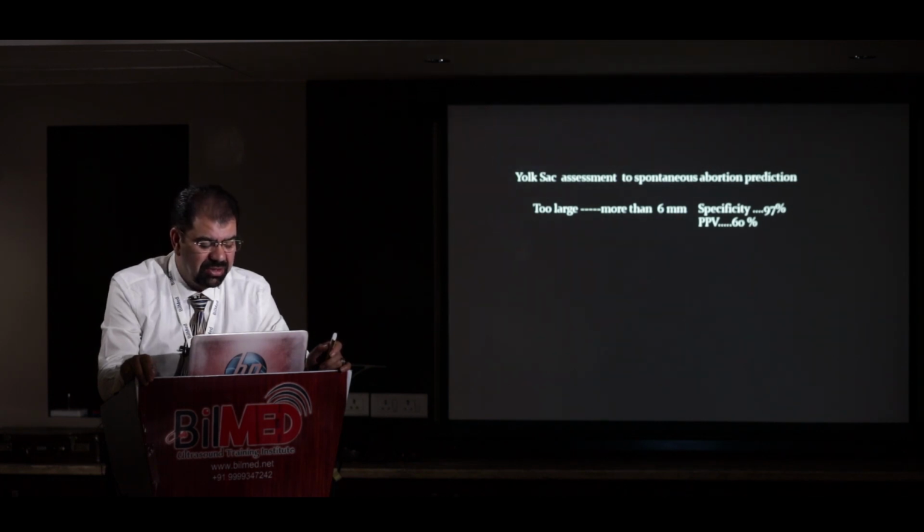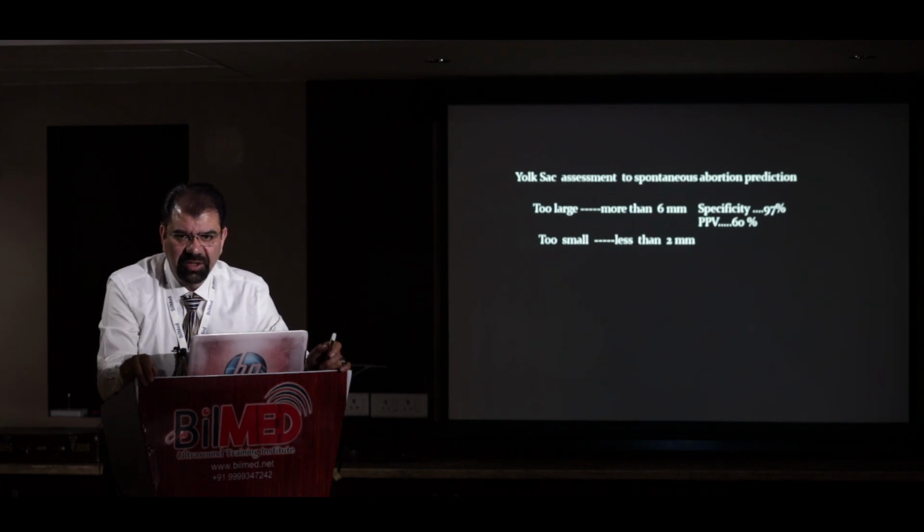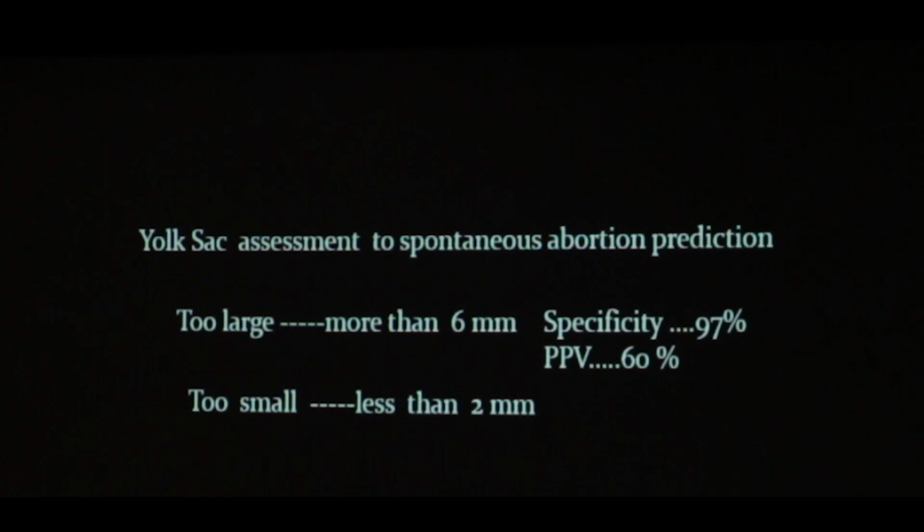And if it is too small, less than 2 millimeters, again, this is an abnormal sign. Please see to the fetus. Maybe the fetus is not pulsating today, and even if the fetus is live today, there are high chances that he will be aborting very soon.